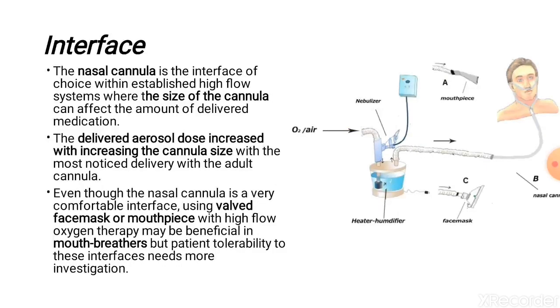Interfaces: some patients are mouth breathers, so it's not possible to use the nasal cannula. So either use a mouthpiece or a face mask with them, but the compliance is less than with the nasal cannula method.